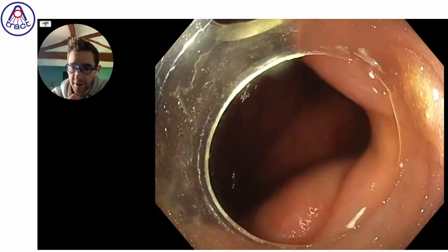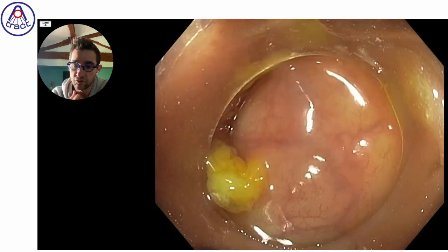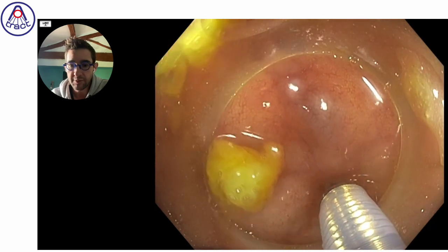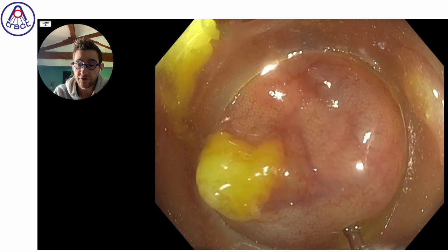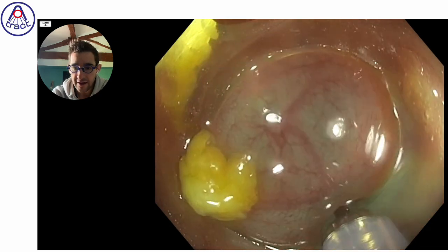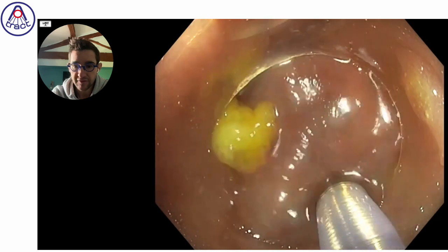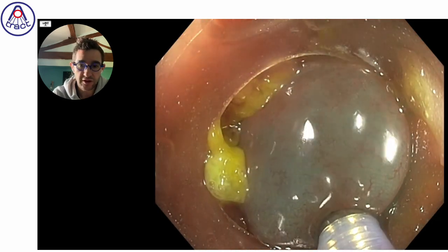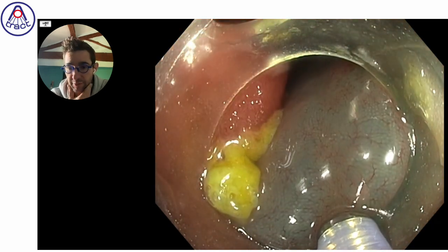So for me, the most difficult in this case is to do the incision on the valvular lip and in the caecum, because if you inject first the anal edge of the lesion will turn to the caecum, and in this case, it was impossible to do a complete retroflexion in the caecum because the scope maneuverability was not perfect.